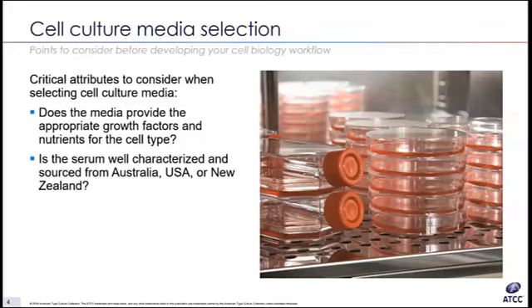Media formulation may also vary from vendor to vendor and may cause osmotic stress to the cells if switched without adaptation. Another important factor to consider is serum. Most cell lines will require fetal bovine serum supplementation to support cell growth. It is critical to source well-characterized sera from locations such as Australia, the USA, or New Zealand. I'll discuss this point in more detail a bit further into this presentation. First, let's start by discussing basal media selection.